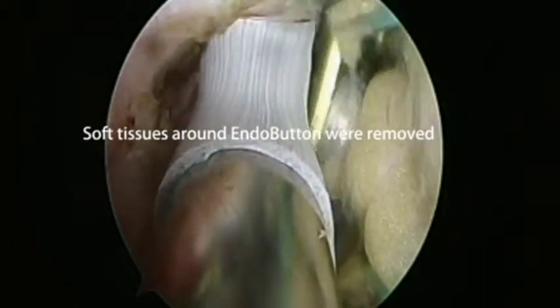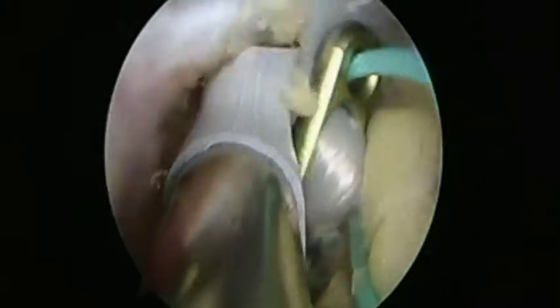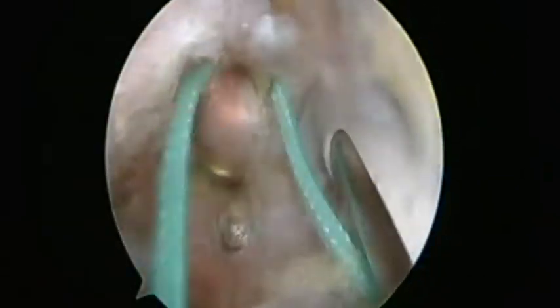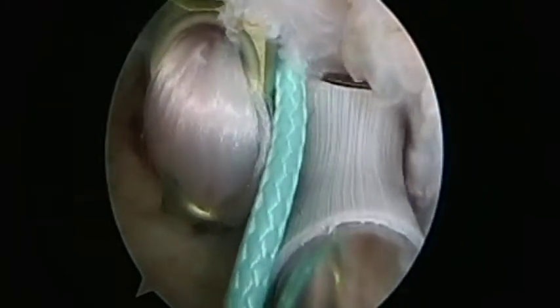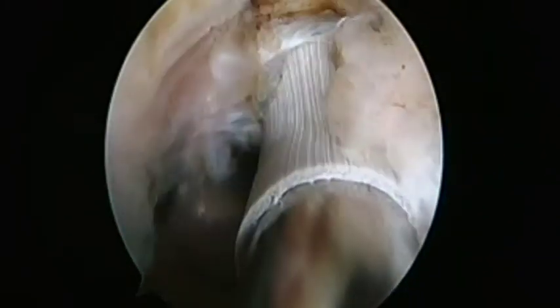A probe was inserted through another lateral femoral portal and the soft tissue was removed. If soft tissue was interposed between the endobutton and the lateral aspect of the femoral cortex, a radiofrequency probe was inserted through another lateral femoral portal to remove the soft tissue.